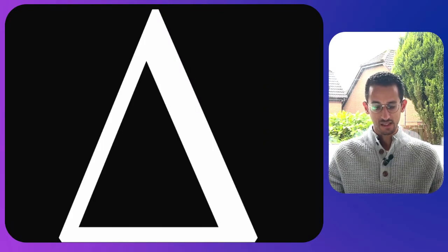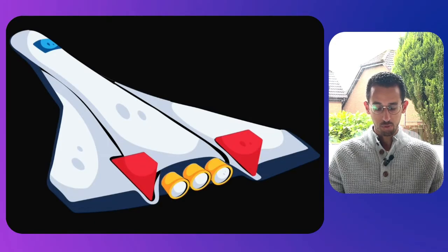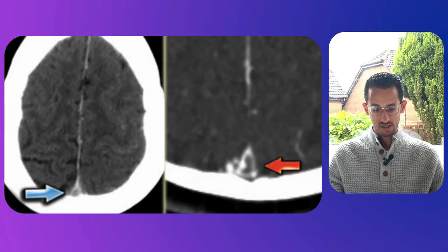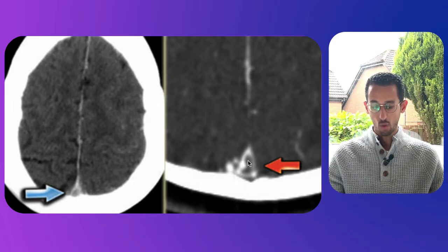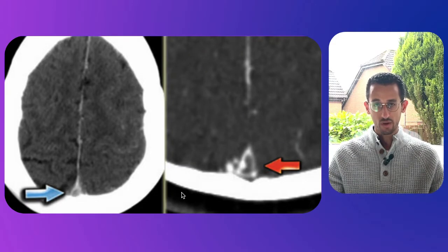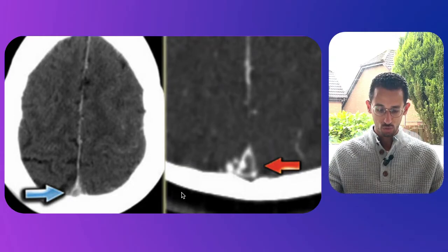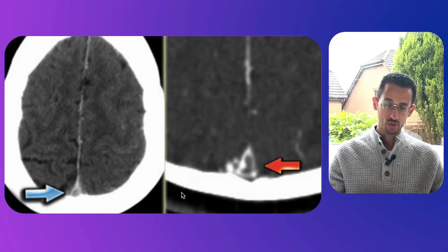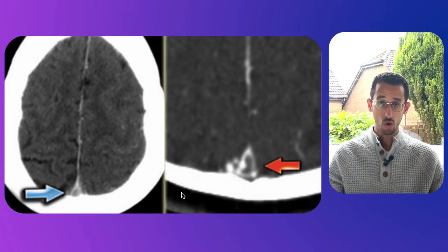Moving to the next one — this is a delta sign, and the delta sign represents thrombosis on contrast CT scan. It resembles a delta-shaped supersonic airplane. Looking at this picture, this is the empty delta sign — it looks like a triangle with an empty space inside. The rationale is enhancement from the outside with a low-attenuating center within the thrombosis. This enhancement is due to the rich dural venous collateral supply around the thrombosed sinus, which produces this central low attenuation on the CT scan.